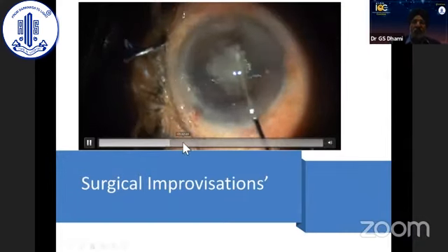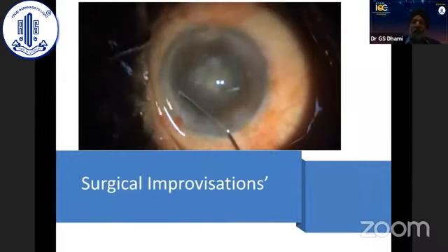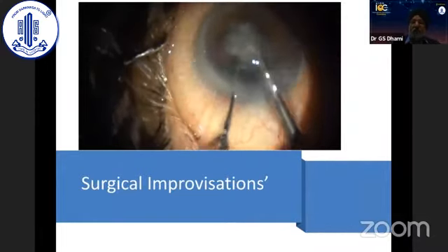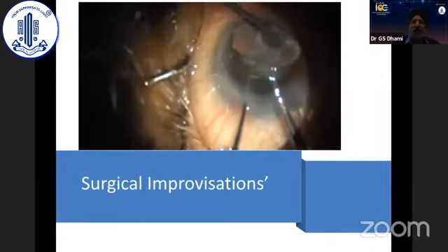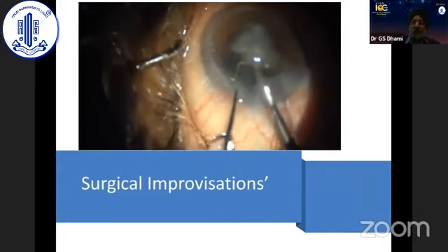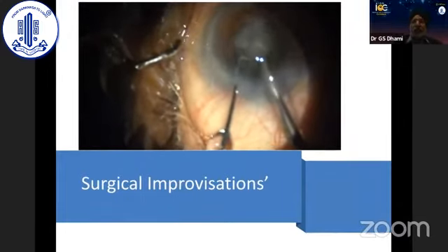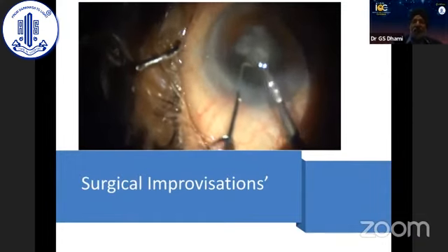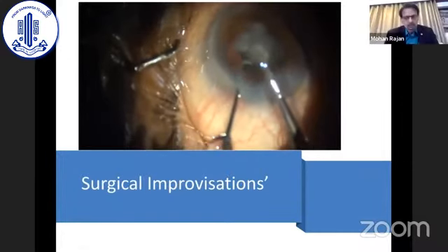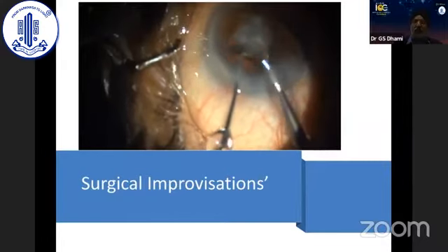A slow-motion phaco with less power, and if you can elevate the whole nucleus, it becomes easy to emulsify under a good viscoelastic in the anterior chamber, supracapsular, and in the iris plane. These cataracts are nearly always soft and come out very easily with phacoaspiration itself, leaving a good cornea behind for the patient's useful vision.